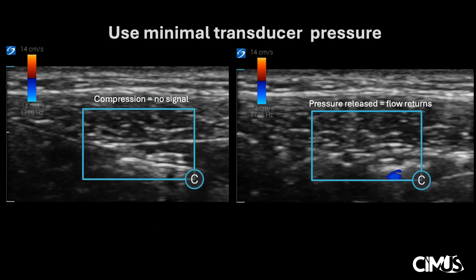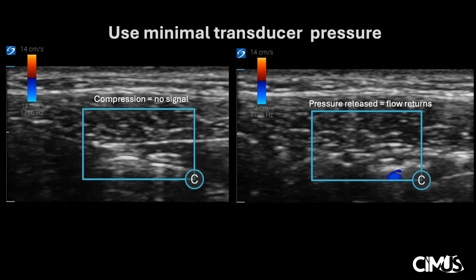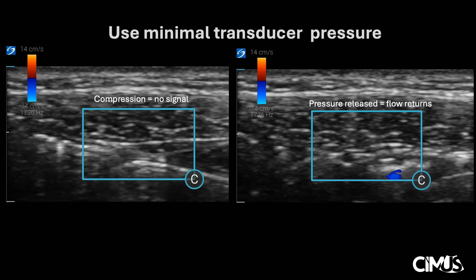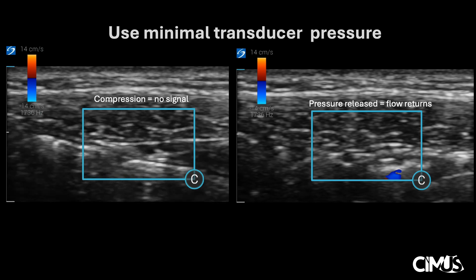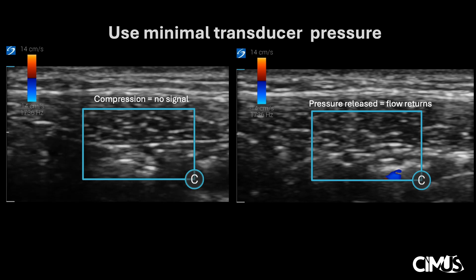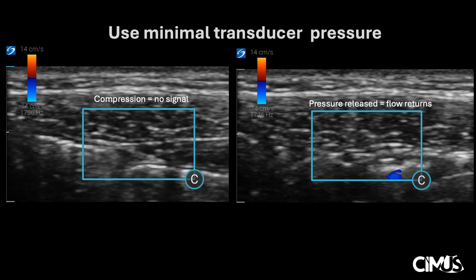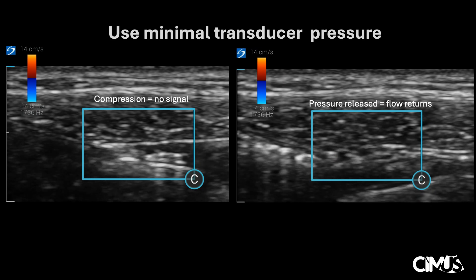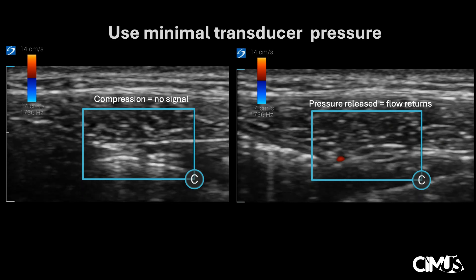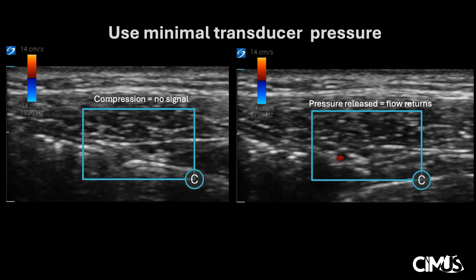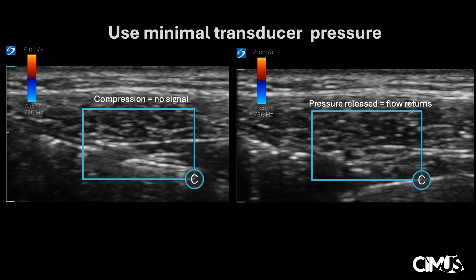Applying too much pressure may compress superficial vessels, tricking us into believing that there are no vessels in the area. On the left, we have a transverse view of the abdominal wall where you could be convinced there are no vessels, given the lack of color Doppler signal. However, the operator is applying significant downward pressure on the abdominal wall with the probe, thus compressing the vessels and resulting in no signal. The same exact view on the right, once the operator releases the pressure allowing the vessels to open up, the signal returns. No settings were adjusted — all that changed was the pressure applied to the probe. Thus, when evaluating an area with a transducer probe, it is important to apply very light pressure so that we are not compressing superficial vessels.